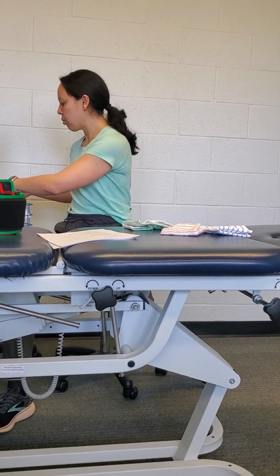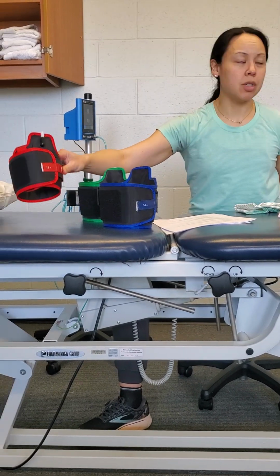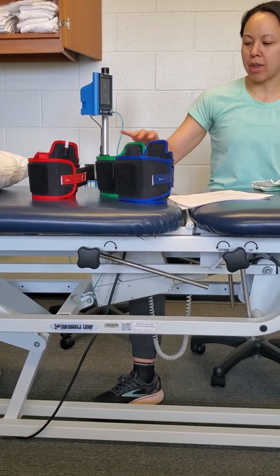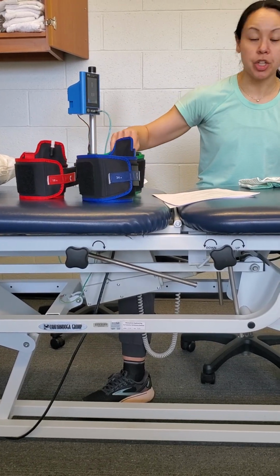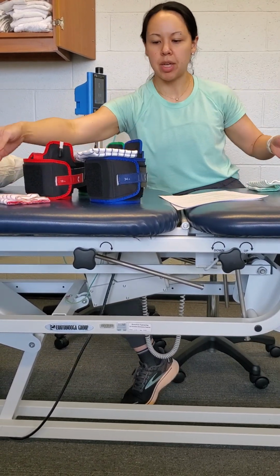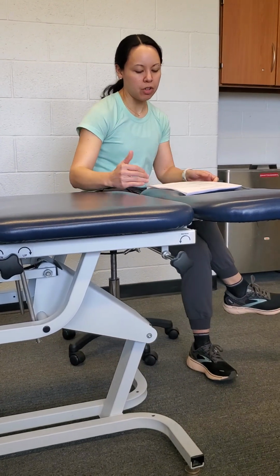So I guess we'll just start with the machine a little bit. These are the three different cuff sizes. For the most part, you're going to be using the red one for upper extremity unless the patient is a really big person and has a lot of muscle mass, in which case you might have to go to blue. But for the most part, red is going to be upper, blue and green are going to be lower. We'll go over how to place those. And these are the three sleeves, obviously color coded, that go with the corresponding cuffs.